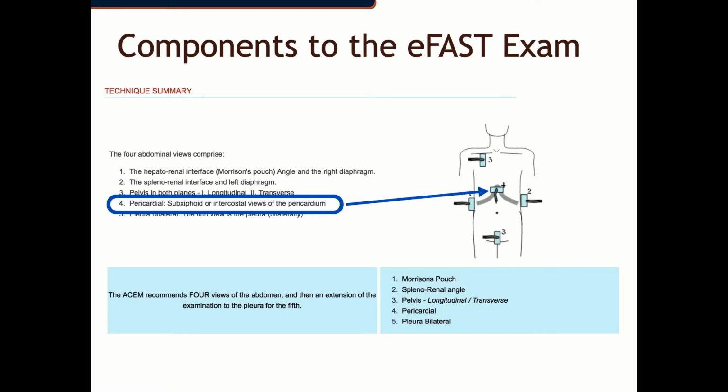So we're going to go step by step and first review it and then scan it through our images. And the first image I will get is the image that I'm presenting first, and it's going to be cardiac. I start with heart because that is the most important item to document for this patient. So regardless of where they are in this list, each of you are going to find your own protocol that will be comfortable for you.